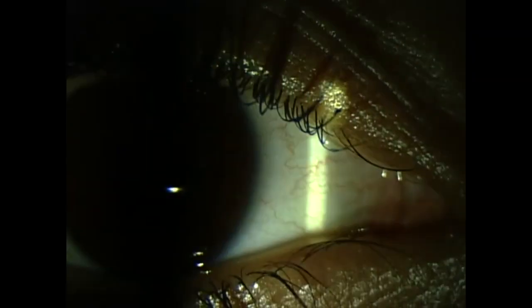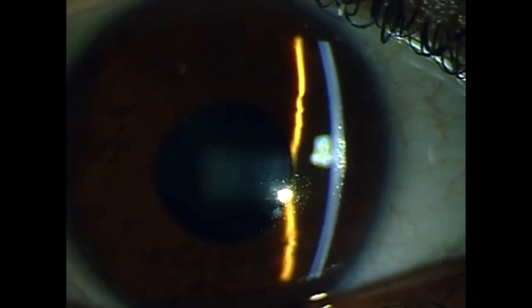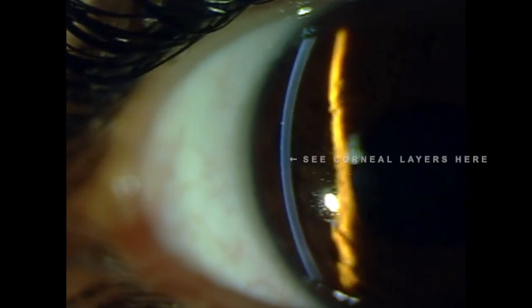Next, look at the conjunctiva and sclera. Have the patient look left, right, down, and up while distracting the lids and looking at the bulbar conjunctiva and fornices. Look for inflammation, masses, foreign objects, or any other abnormalities. Pan over the cornea with a bright, wide beam and examine the epithelium for any defects. Then use a narrow, oblique beam at higher magnification to see deeper layers.